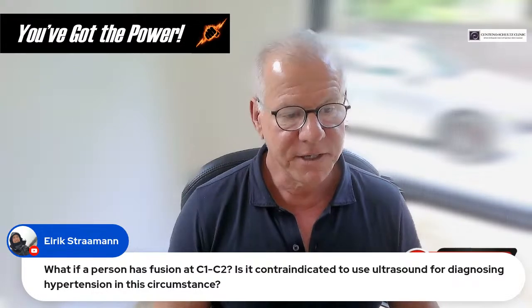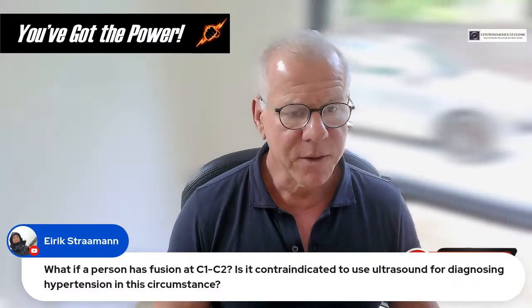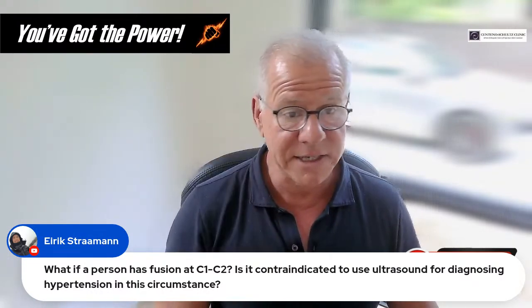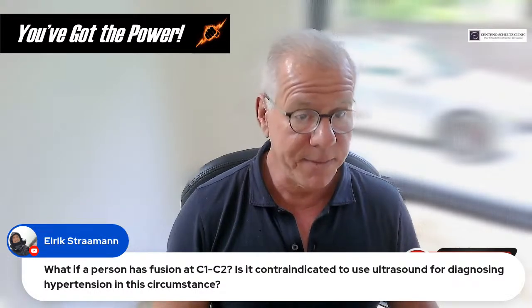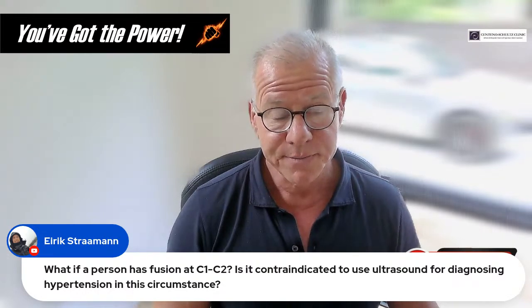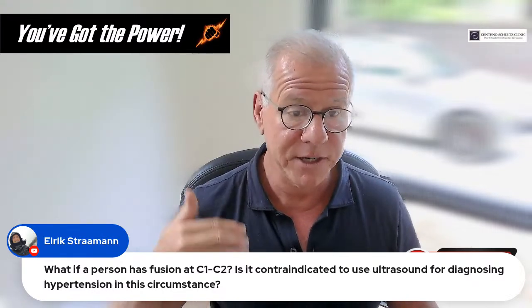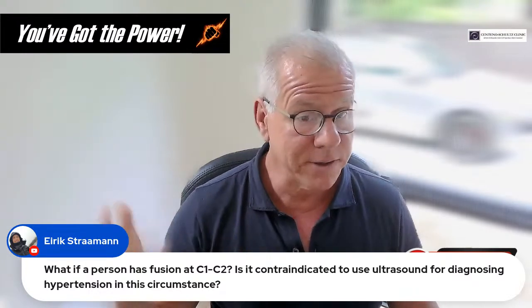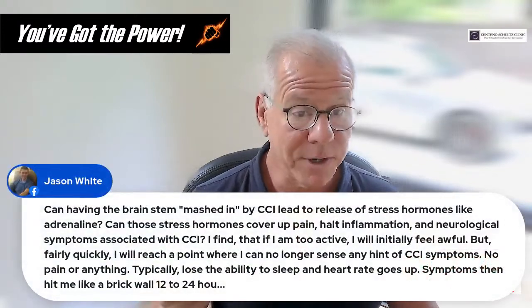Eric, what if a person has a fusion at C1-2? Is it contraindicated to use ultrasound for diagnosing hypertension in this circumstance? I don't think it would make too much of a difference. We're really from the front there, not going to see the fusion at all. So I don't think it's going to change the imaging. Now, could it change the result? It could. That could be a wild card that we don't know about, meaning do patients who have had a C1-2 fusion end up with increased diameters just because they have the fusion? I don't know the answer to that. I don't think anyone does.